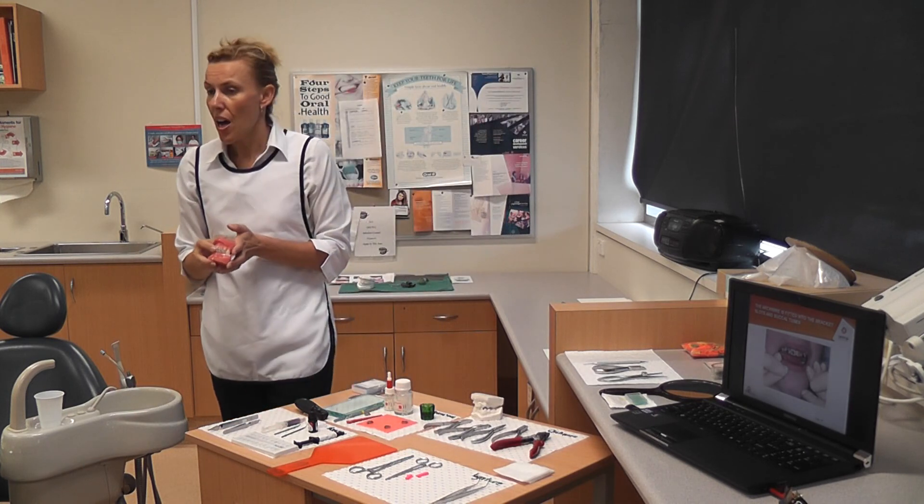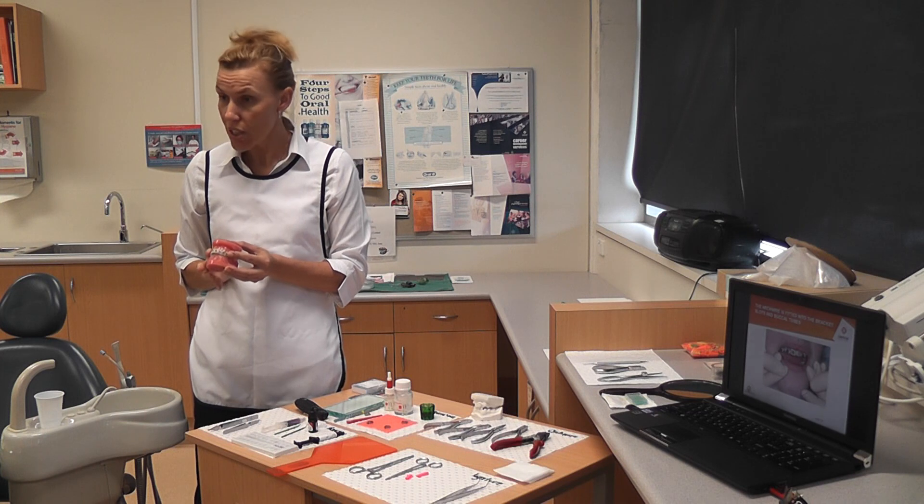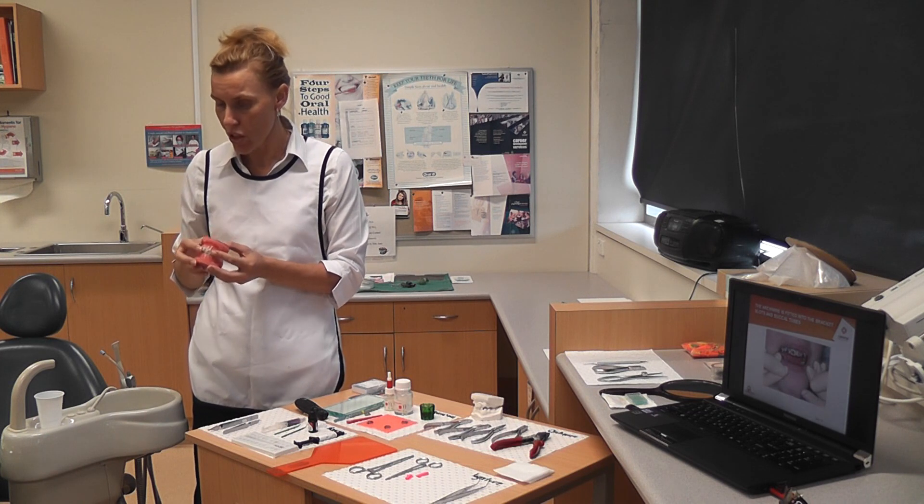That's pretty quick actually — the arch wire placement. Has anyone got any questions on the arch wire placement? So that's the third stage. We've finished that one and we've got one to go.